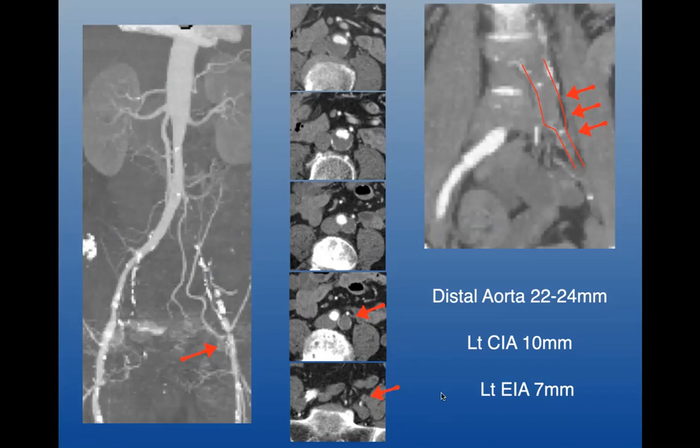So for the common iliac arteries, my plan is I'm going to basically go right groin up and over so that I can do diagnostic angiography from there. I'm going to basically get access on the left side retrograde, and I'm going to try my recant from there and see how far I can get. And the reason I'm saying that is because I have a flush occlusion here. And so trying to figure out where this origin is going to be very difficult. So I thought, let me start here and head this way first and then see where I end up.